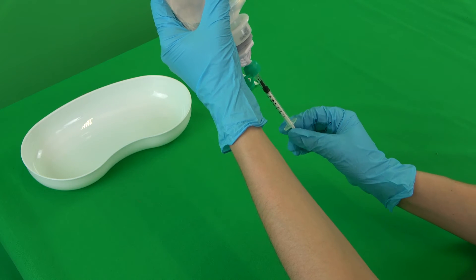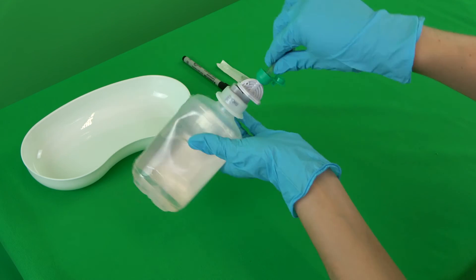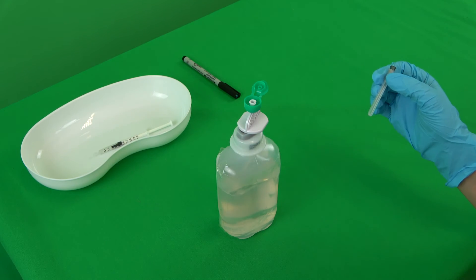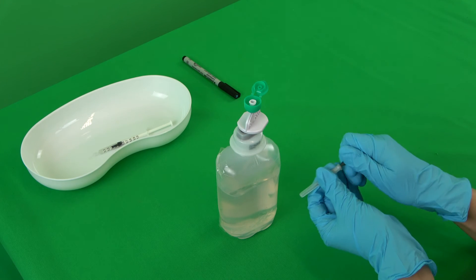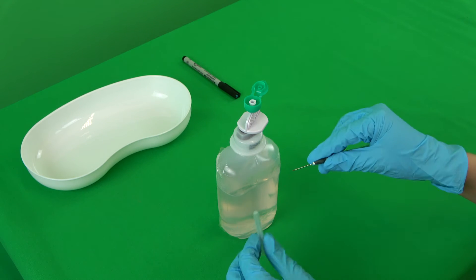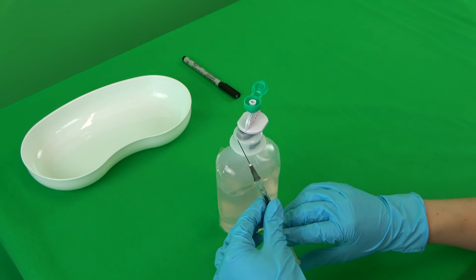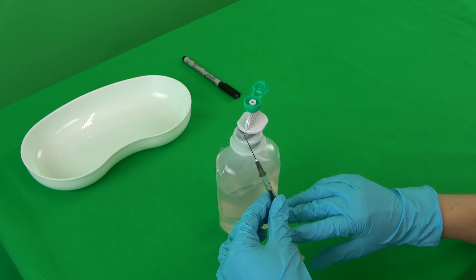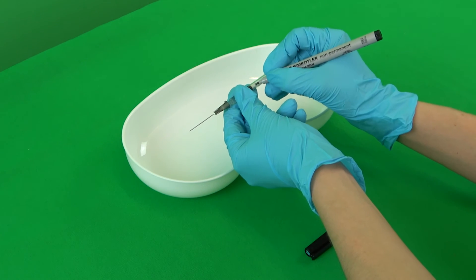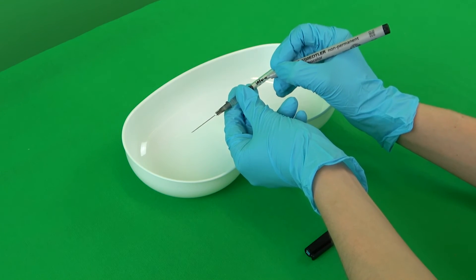First, all the needed materials are placed within reach. The medication is drawn up in advance and a fitting cannula is placed onto the syringe. Each medication which will be applied subcutaneously should be able to be injected easily. The air is pressed out of the cannula. Each syringe is labelled with the name and volume of the solution. The person applying the injection should be wearing gloves.